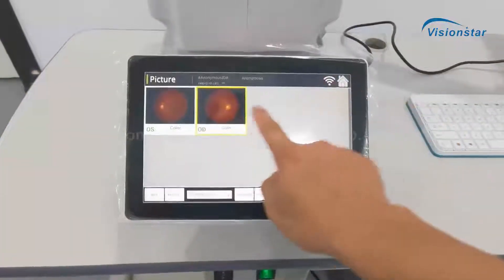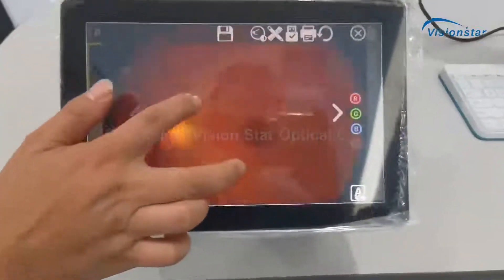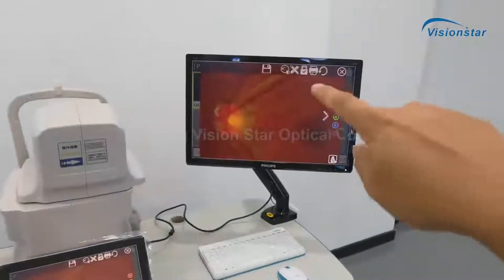This is the other eye — just now we took both eyes. You can see both images and you can also view them from the bigger monitor.